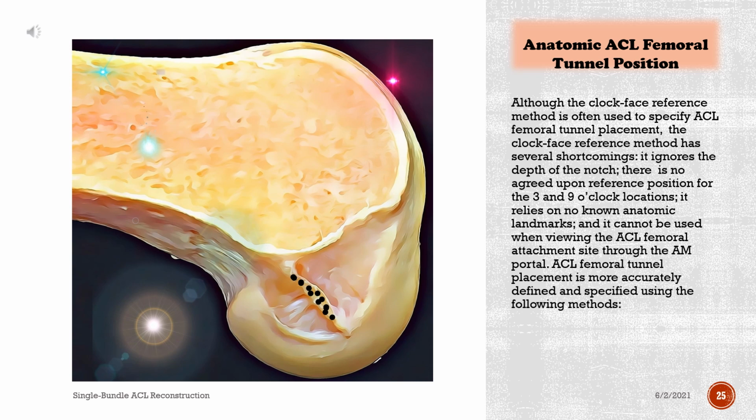There is no agreed upon reference position for the 3 and 9 o'clock locations. It relies on no known anatomic landmarks, and it cannot be used when viewing the ACL femoral attachment site through the AM portal. ACL femoral tunnel placement is more accurately defined and specified using the following methods.